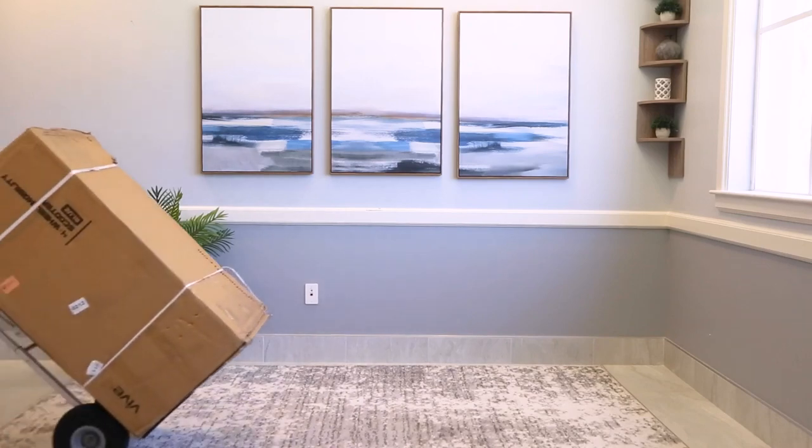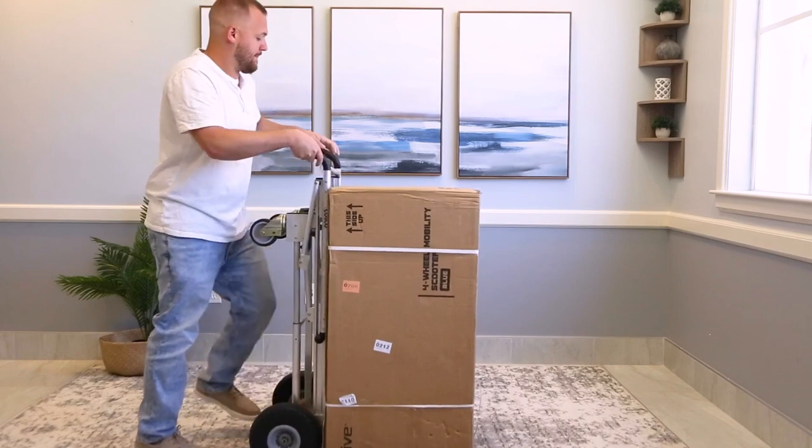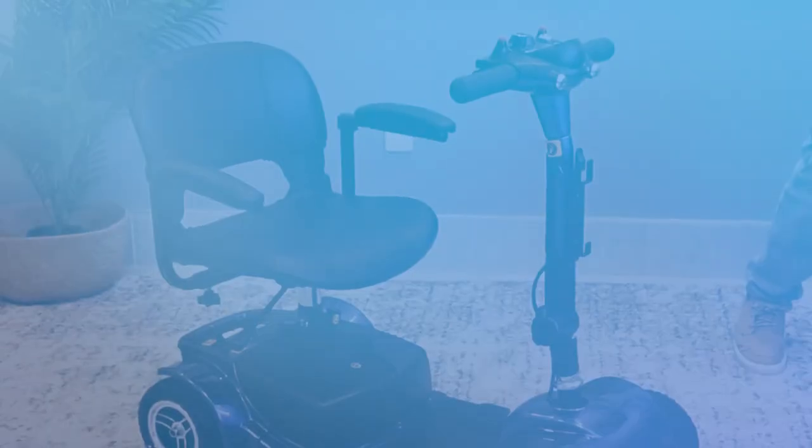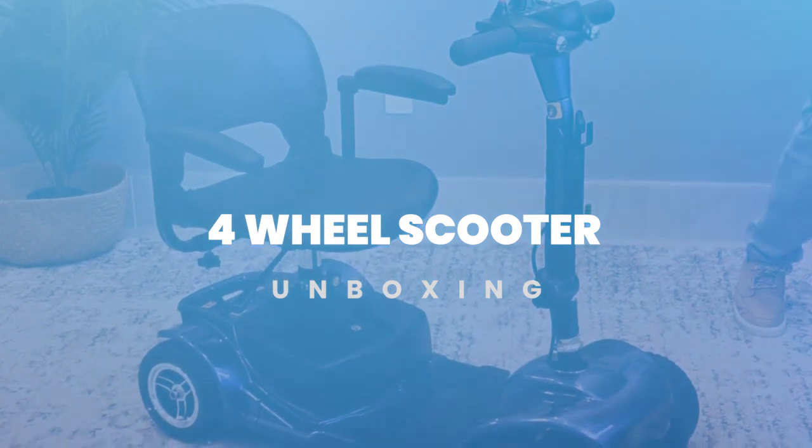If you're watching this video, it's probably because you just treated yourself to the Vive 4-wheel mobility scooter. Congratulations and thanks for choosing Vive. In this video, we are going to show you the easiest way to unbox your new favorite essential.